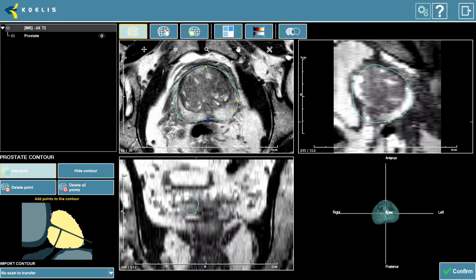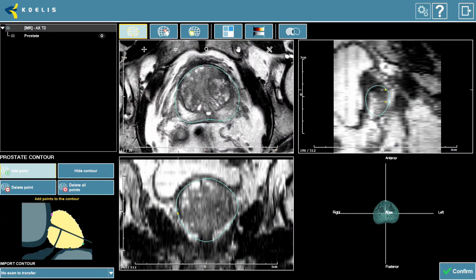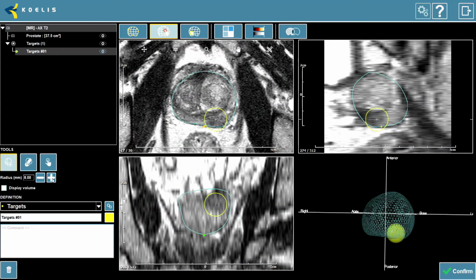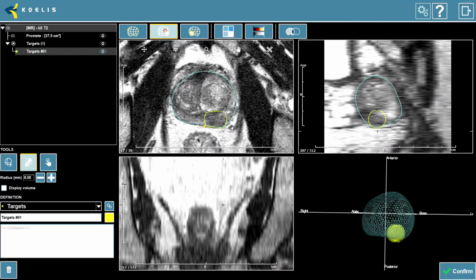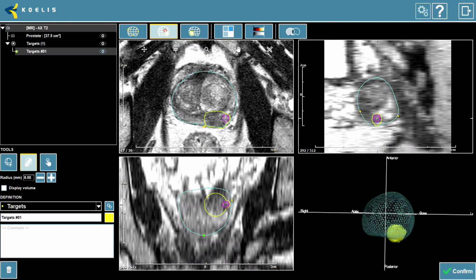Prior to the procedure, the patient's MRI images are contoured and segmented on the MR-Draw workstation. This includes separate segmentation of the gland itself and any regions of interest. Once the images have been prepared and a 3D representation of the prostate has been rendered, the MRI images are transferred from the MR-Draw workstation to the Trinity biopsy platform.